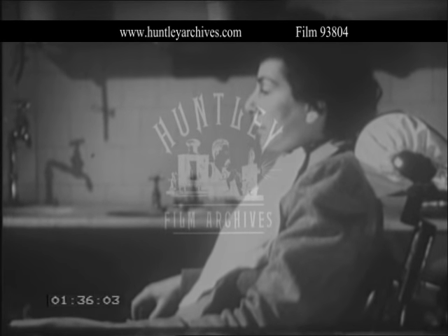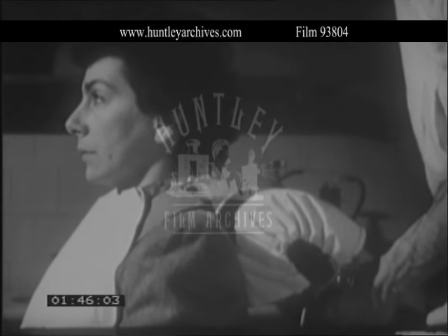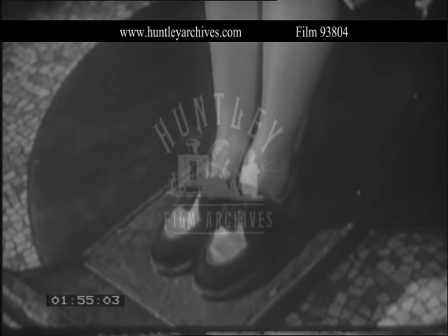The position in the chair is important. Ask the patient to sit as upright as possible so that the lower part of the spine is brought into contact with the back of the seat. Then adjust the headrest to support the neck in an almost vertical position. The headrest must be well under the occiput, and feet must rest flat on the chair and not be allowed to obtain a purchase on the footrest.